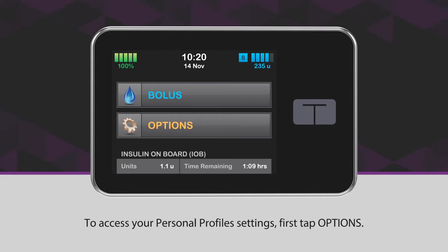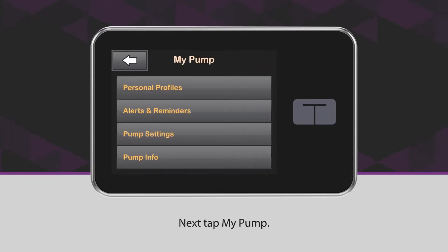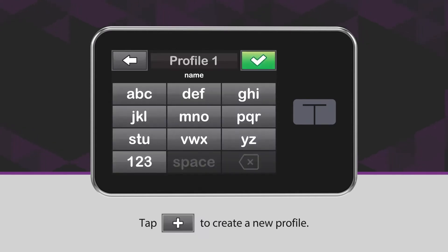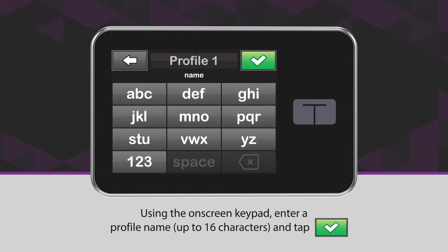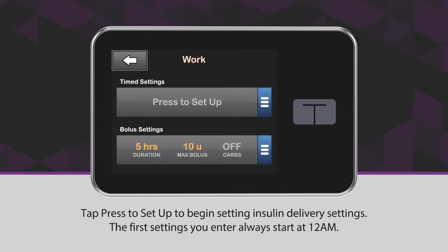To access your personal profile settings, first tap Options, then tap My Pump, then tap Personal Profiles. Tap the plus icon to create a new profile. Using the on-screen keypad, enter a profile name up to 16 characters and tap the green checkmark icon. Tap Press to Set Up to begin setting insulin delivery settings.